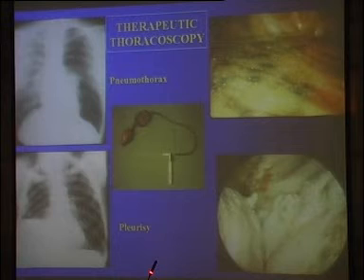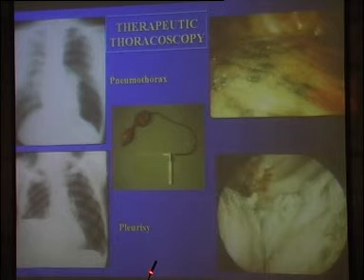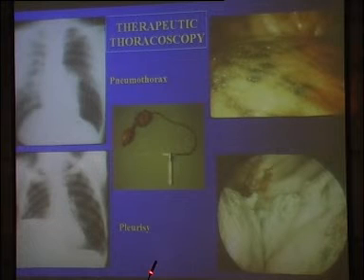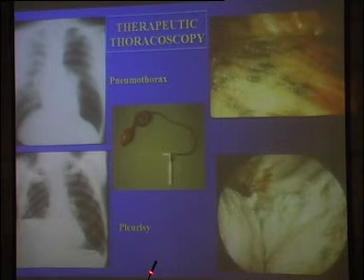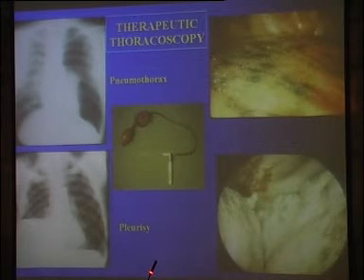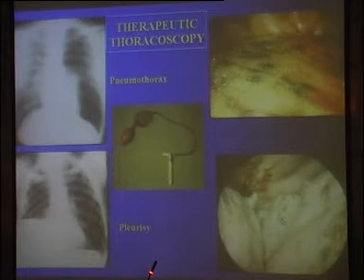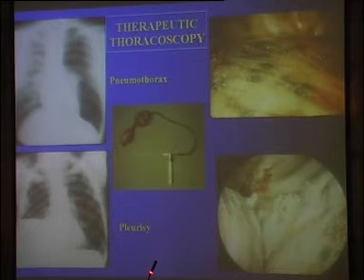The second point is for recurrent malignant pleural effusion. You mean talc slurry in comparison to talc poudrage. In a study carried out by the American group, in the majority of recurrent malignant pleural effusions that come from lung cancer or breast cancer in women, there is a statistical superiority of talc poudrage in comparison to talc slurry. I will show you this too. And then you have to get such spreading of talc into the pleural cavity, which is important. In comparison to this, it's bad, very bad talc poudrage. It's very good talc poudrage, you know? I will explain a little bit later why.